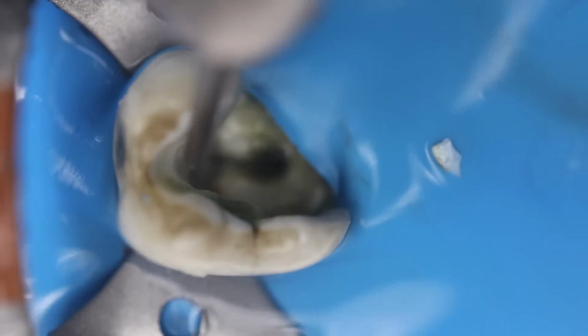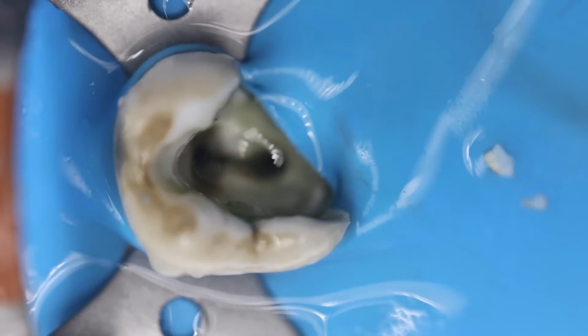Angulate your bur occlusally and incline it so that there is no vertical wall remaining and it is roughly rounded. There is one part left over here, we can just round it off also.